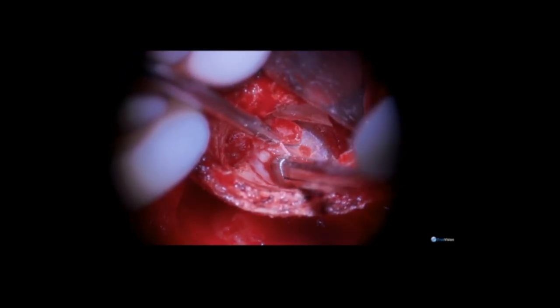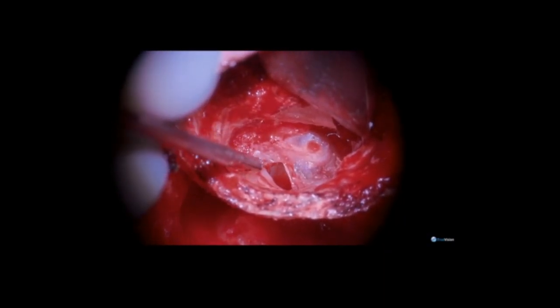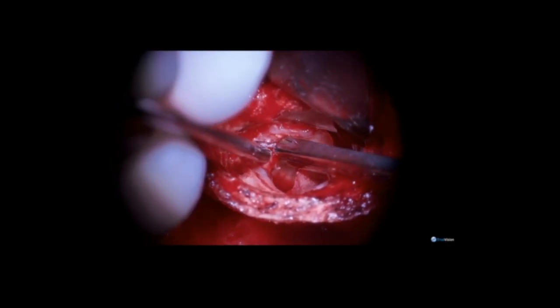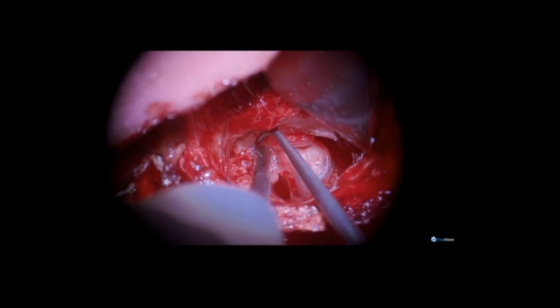Here I am once again using the malleus nipper to separate the malleus just distal to its attachment to the tensor tympani tendon so that the tympanic membrane remnant is one intact portion separated from the cholesteatoma and neck.